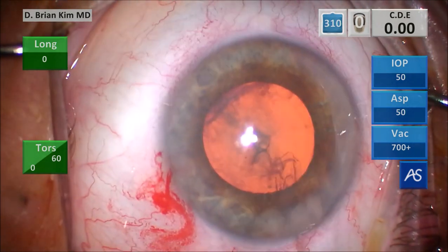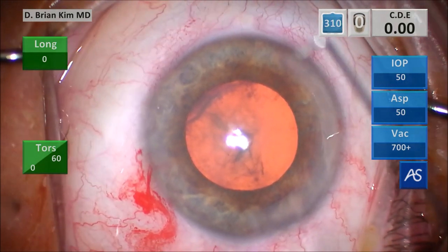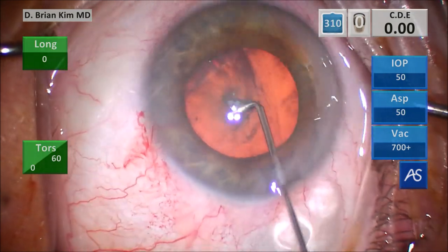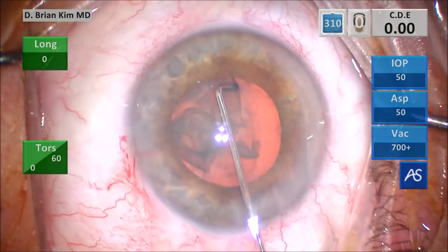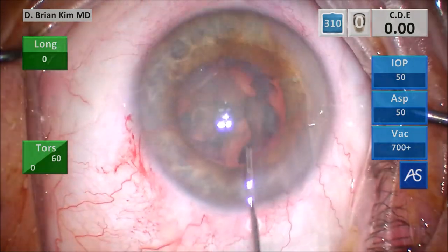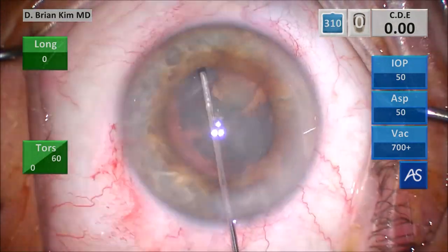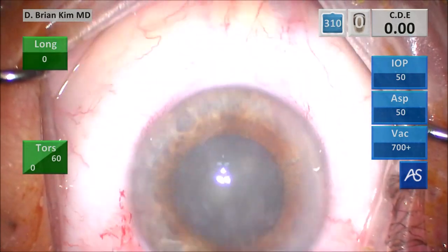I go ahead and finish off the rhexis, burp some viscoelastic out. This is the capsular fornix hydrodissection technique. I place the cannula under the rhexis edge, contra-incisionally, point the tip down. I didn't get a very good wave there, but a little bit. Decompress on the left side, turn the cannula to the right pointing down. You can see the lens starts to spin a little bit here. As I push it side to side, I'm able to get the lens to turn quite nicely.